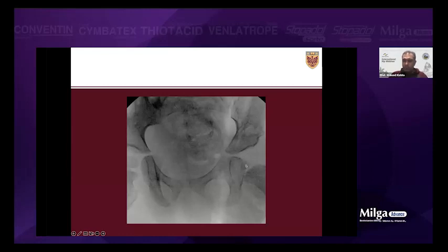After that, I will get the straight head of the rectus tendon, the one that I reflected. Then I suture it back. It doesn't have to be super tight. And then you suture it back to the origin or the small part that you mark. But as I mentioned at the beginning, I mark both ends. And then you place a careful couple of sutures at the interval that you did for the fascia. Don't do it super tight because you might not see the lateral cutaneous nerve of the thigh, and then you do some impingement with your suture.